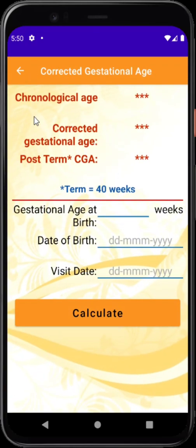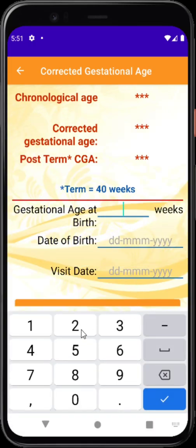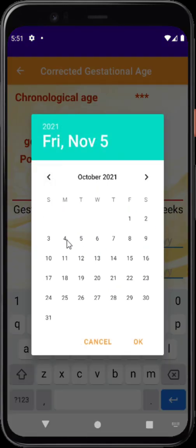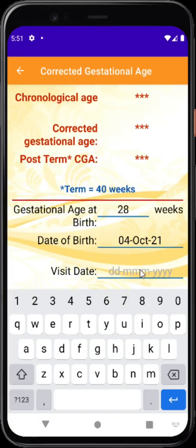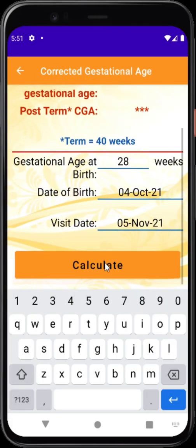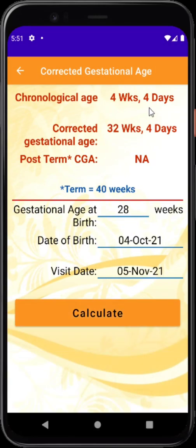Coming to gestational calculators, these are very handy. For example, to calculate the corrected gestational age and chronological age, you type the birth gestation — say 28 weeks — then select the birth date from the calendar and the visit date. By default it will be today, but you can select any date. Click OK and then calculate — it gives the chronological age and corrected age as of the visiting date.